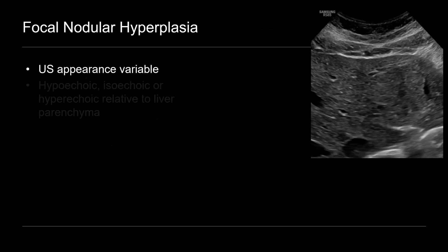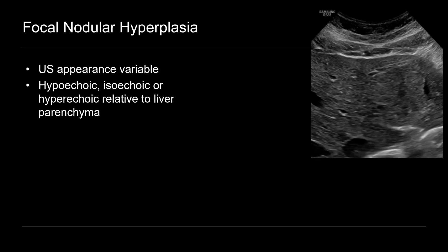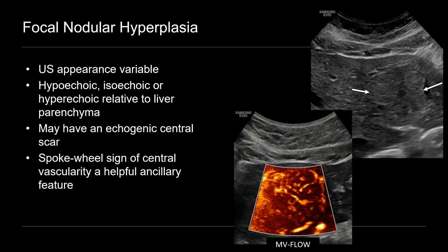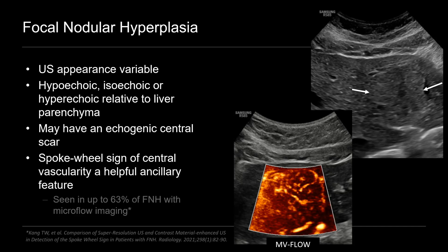And the ultrasound appearance is variable. FNH can appear hypoechoic or darker than the liver, isoechoic or similar to the liver, and even hyperechoic, brighter than the liver parenchyma. And here's a different patient with FNH. It's rather subtle, but you can see that it's slightly echogenic compared to the adjacent liver parenchyma. There may be an echogenic central scar to the lesion. And a helpful feature is the identification of the spokewheel sign of central vascularity. And just like with the last case, that's often better seen with MV flow or microflow imaging — this stellate central pattern of flow. One study showed that this is seen in up to 63% of FNH.